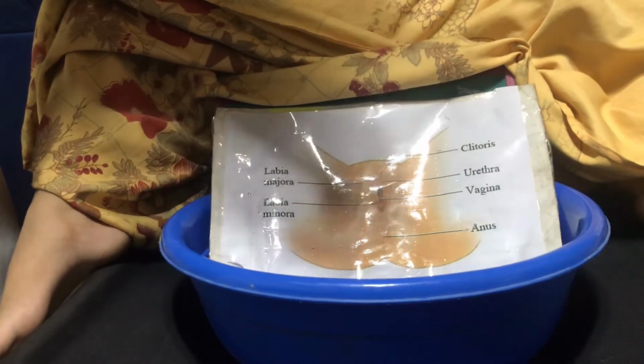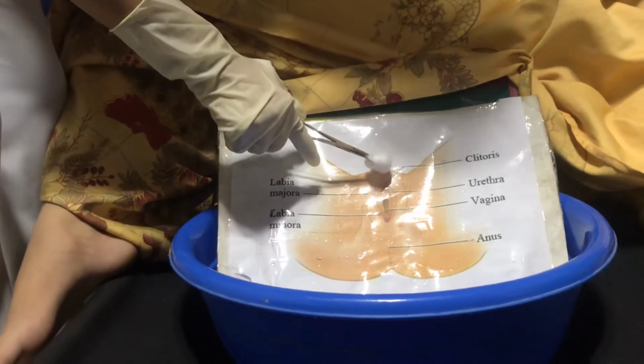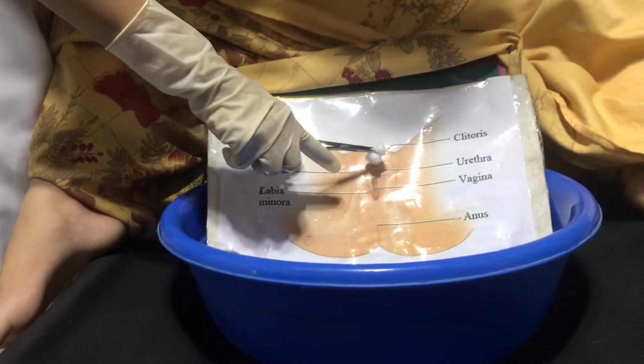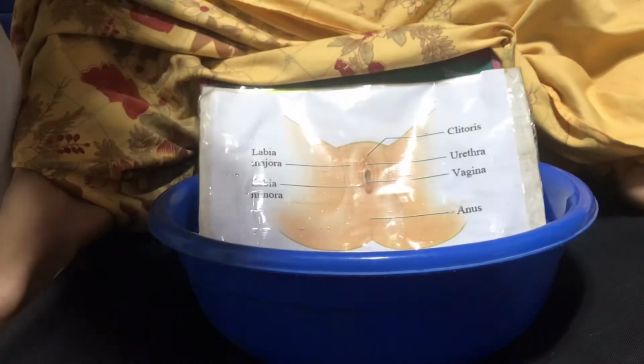Using the 7 dry cotton balls, dry the perineum with the same strokes as what we did earlier. The first, from symphysis pubis down to the anus, then discard. Second cotton ball, do the figure of 7 from the anus and discard.